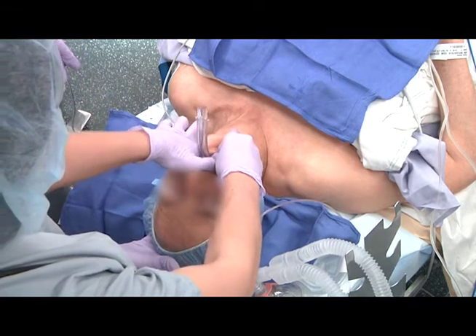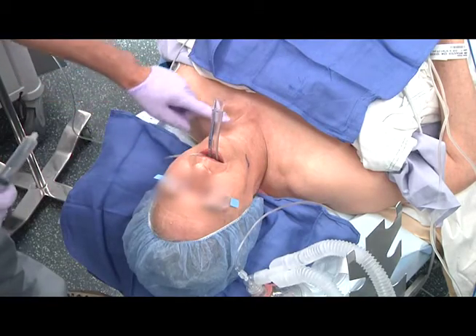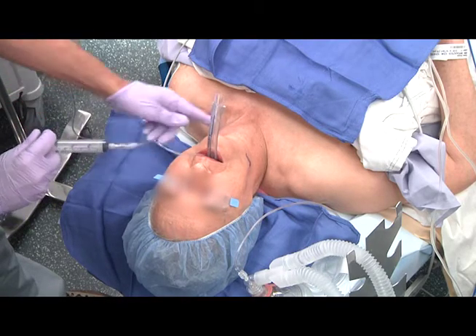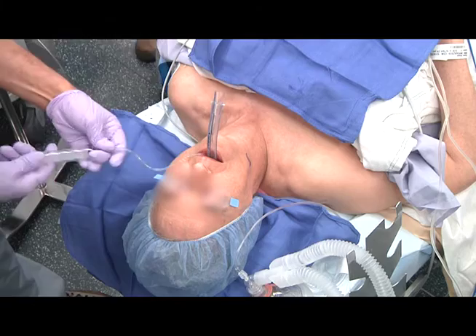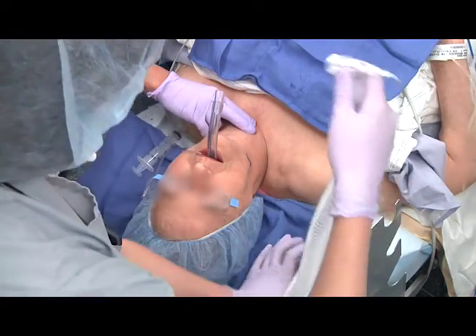The LMA device and the finger is inserted deeply into the airway until resistance is met. The LMA cuff is now inflated. After placement of this particular LMA, the patient could be ventilated but a significant leak was appreciated.